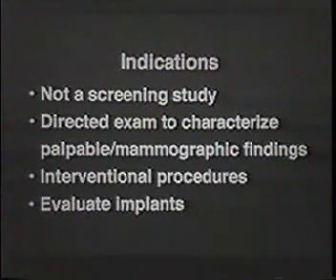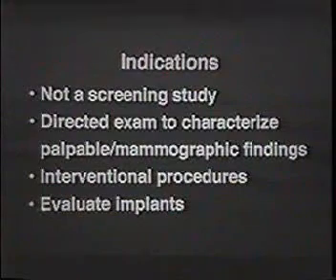And for core biopsy or fine needle aspiration of the breast, many prefer sonography, and most who do core biopsy or needle biopsy to any degree will use both X-ray guidance and sonogram guidance, and they'll vary that according to the case, whichever is best suited for that particular case. It can also be used for other interventional procedures, which we'll talk about in a minute. It's also been used to evaluate implants, particularly silicone implants in the breast.